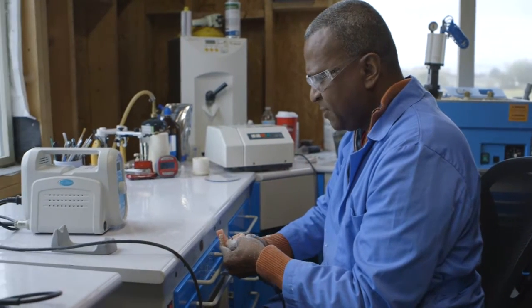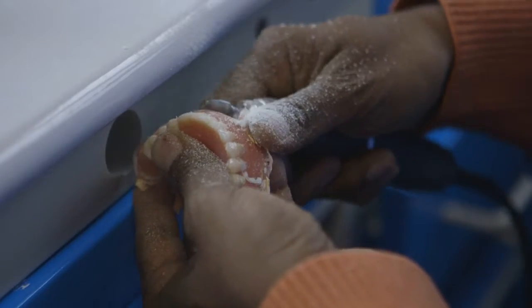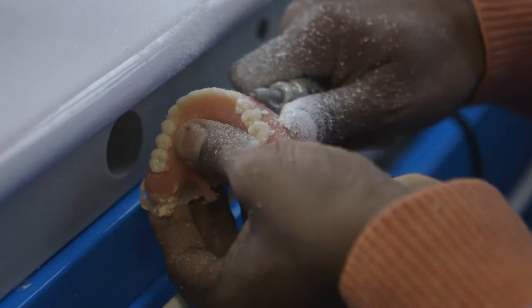We process the dentures, and the technician is able to finish them and polish them and create subtle details that allow them to be lifelike and fit very well. In the end, the patient is able to chew better, their confidence is much higher, they feel great, and a lot of our patients are very, very happy.